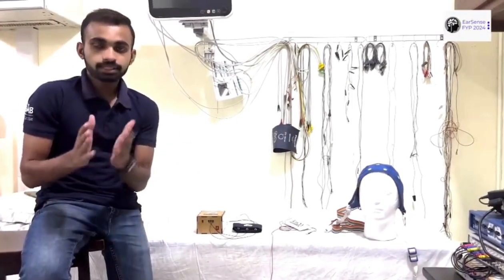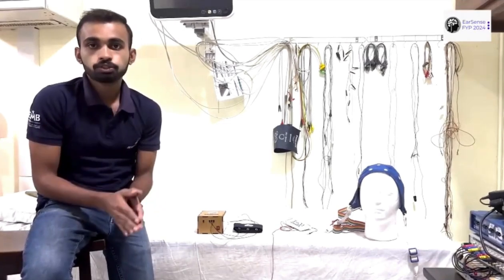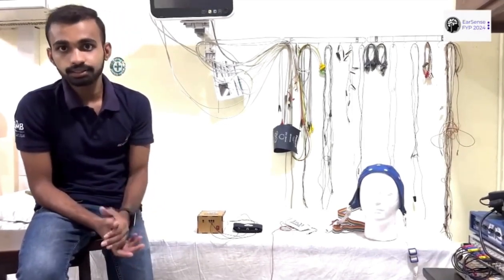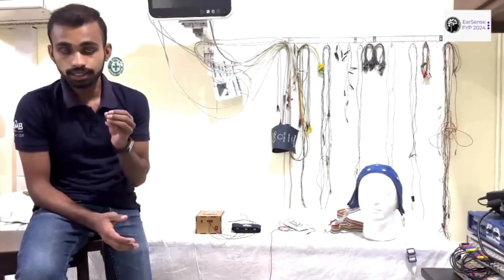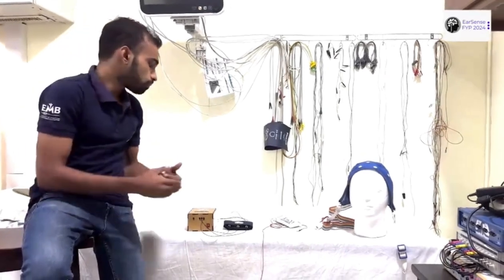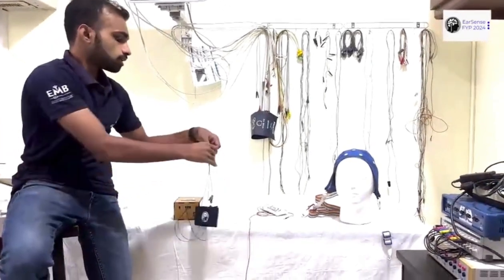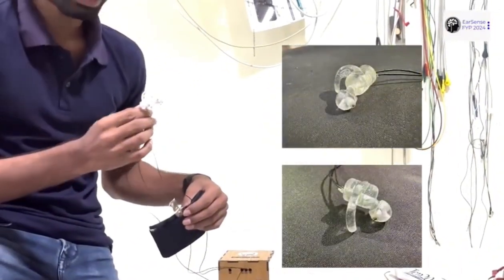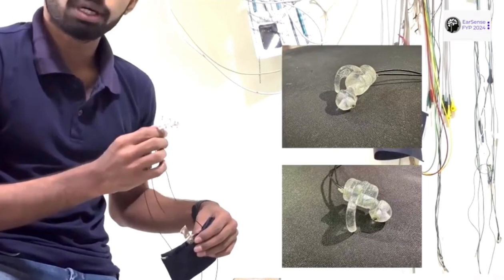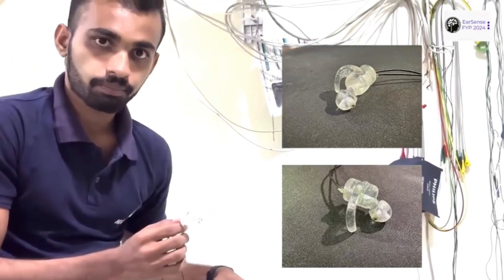Because of that, researchers are now moving towards collecting EEG signals through the ear. Most of the research is based on making earpieces specified for a special customer. As a research team from the University of Moratuwa, we are proposing an earpiece that comes in 3 different sizes that could fit a majority of the population.